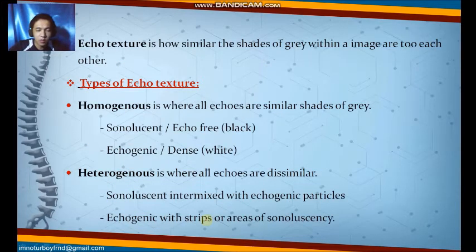Okay? So echo texture, it was mentioned yesterday, what are the echo textures? Or basically, to define it in basic words, they are the colors that you see on the ultrasound. So echo texture is how similar the shades of gray within an image are to each other.